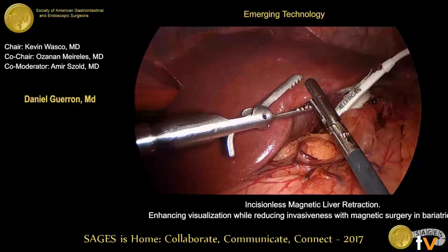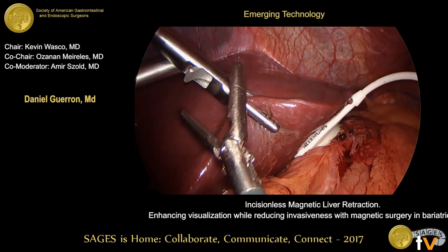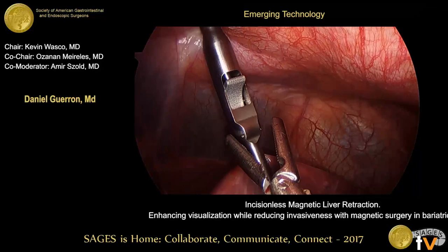The liver is re-grasped and opposed to the abdominal wall using the external magnet. As you can see, the external magnet can be manipulated in such a way that it will walk along the abdominal wall, creating the retraction that you want.